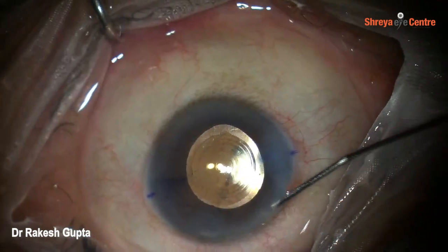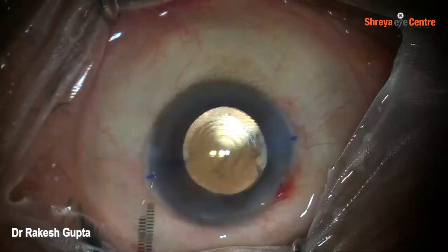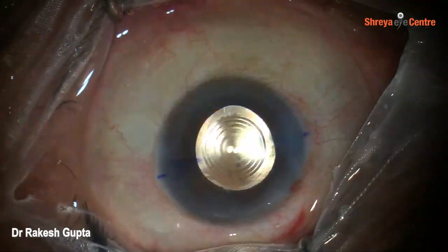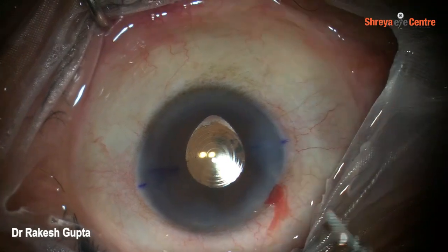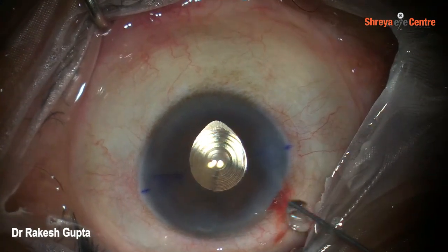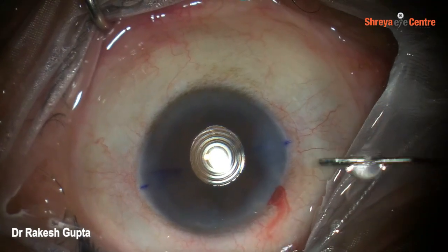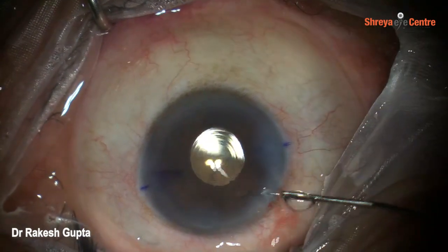Now I have injected pilocarpine into the anterior chamber to constrict the pupil. This helps in multiple ways. First of all, it will confirm that there is no vitreous in the AC, and it will also confirm the alignment of the IOL with the pupillary axis. And you can see all the multifocal rings on the IOL are very well centered.